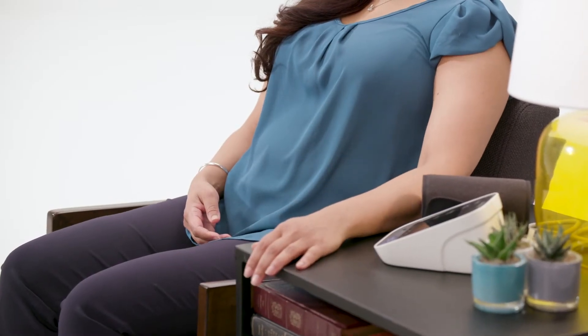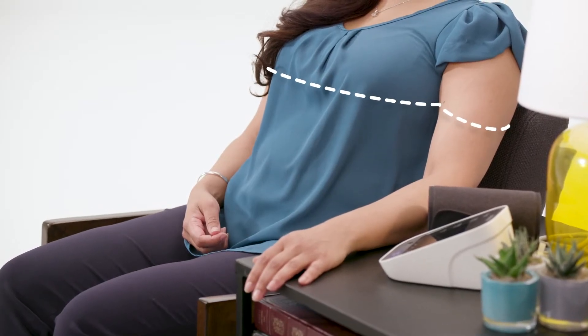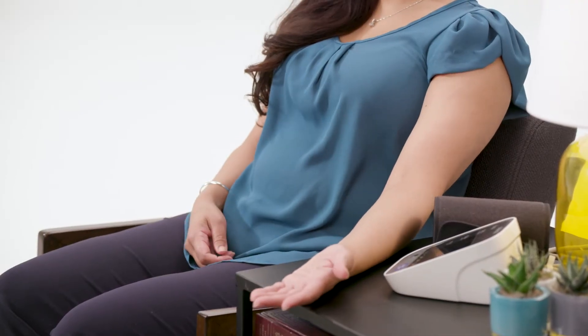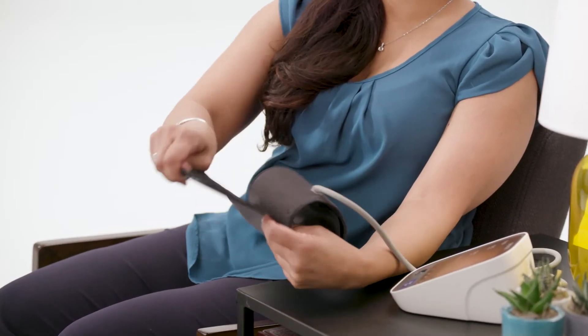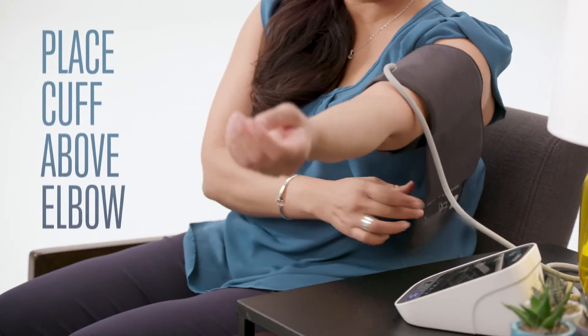Rest the arm you will use to measure your blood pressure on a firm, flat surface at roughly the level of your heart, which is about mid chest. Have the palm of the hand of that arm face up to relax all of the muscles in the arm. Place the blood pressure cuff on your bare upper arm so that the bottom of the cuff is just above the elbow.